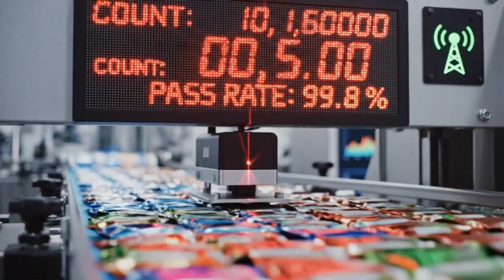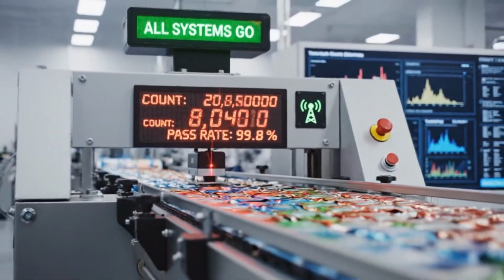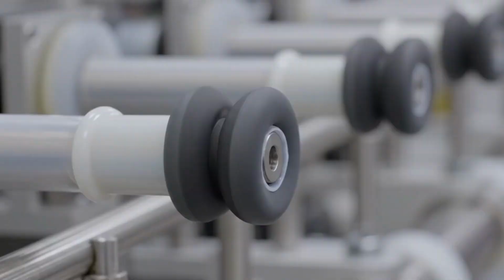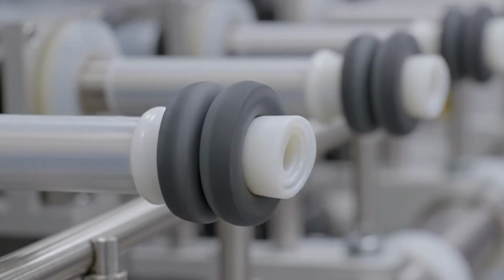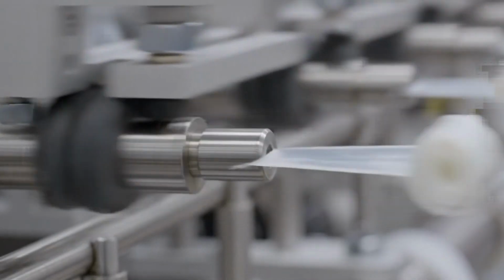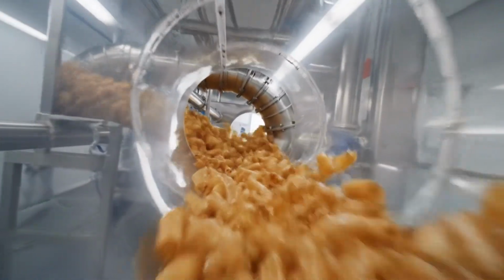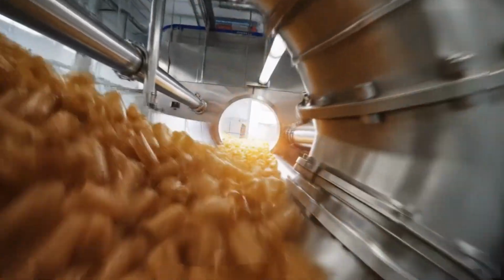We track every batch in real time. If the pass rate drops even slightly, the entire line is halted. This rolling process prepares the condom for its final lubricant application and individual foil sealing. Having proven their strength, the condoms move to the final stage of their physical transformation.